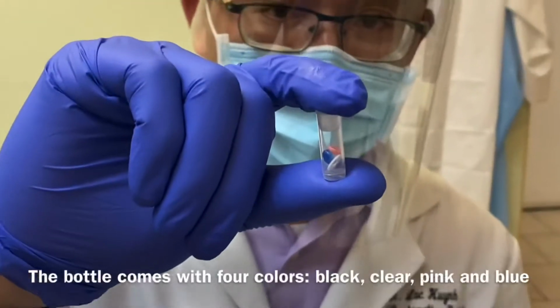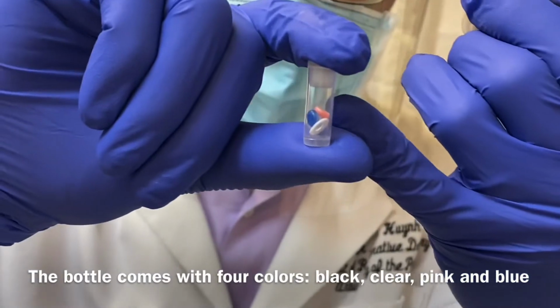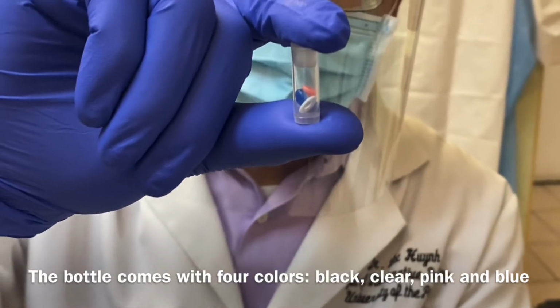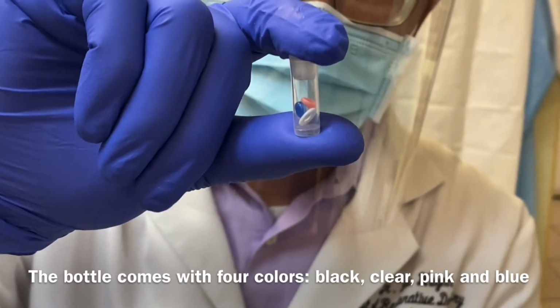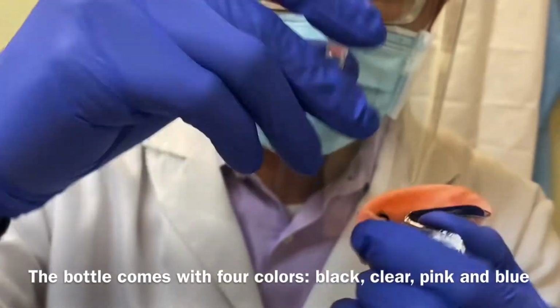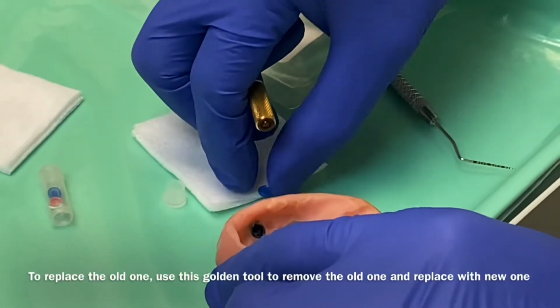What we have here is 2-3 different colors, pink, blue, and clear. Each of them represents the retention level of the overdenture. So we're going to pick one of them and place it in here. Pick this out.